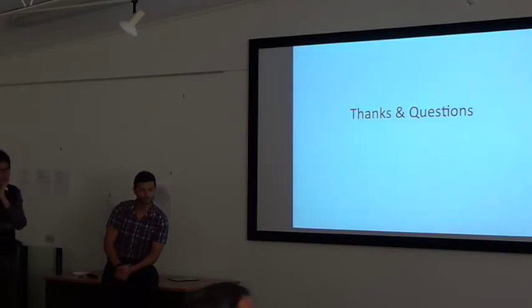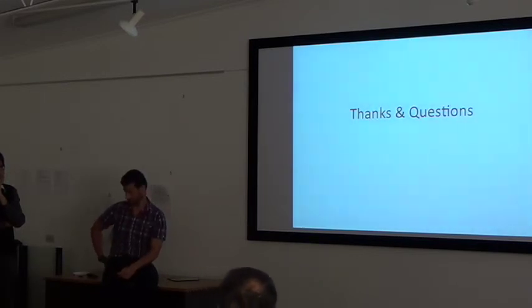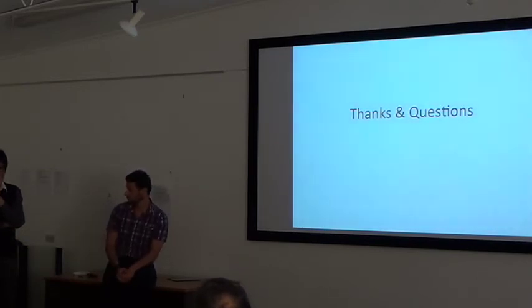Do you get much trouble with shims? Do you find manual shims work, as opposed to automatic shimming? I was wondering about the MEGA-PRESS sequence and whether we'd have the same issues. I haven't done MEGA-PRESS on our scanner. For the traditional sequence, I think manual shimming does the work. I have tried to scan some MEGA-PRESS sequences on the trial scanners at Swinburne University, where the radiographer does very good manual shimming, and we get some good signals from the phantom. It depends on your scanner as well, and on how good your magnet is.